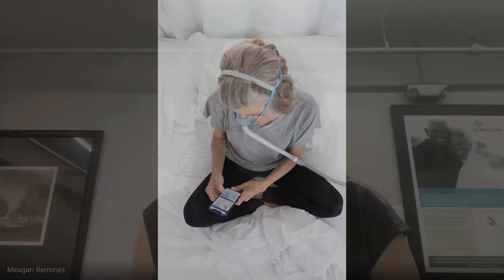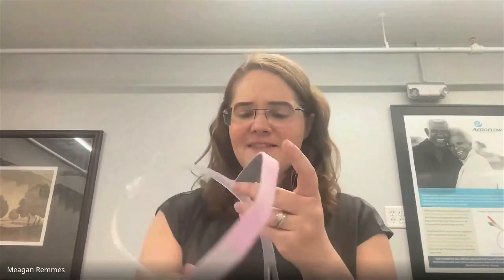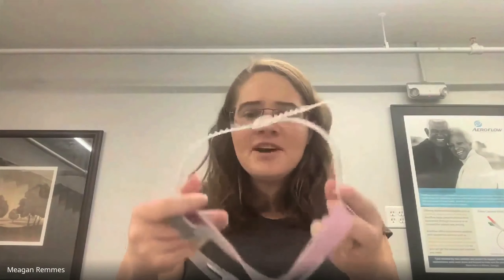That makes perfect sense. I actually have a CPAP mask here with me and I see that it has all of these extra head straps that need to be adjusted, but I'm not entirely sure — is this the way that it goes on? Is it going to be comfortable for me, or what do I do to loosen it or tighten it?